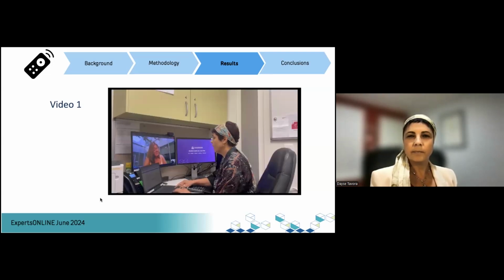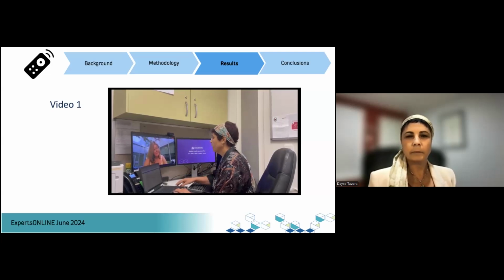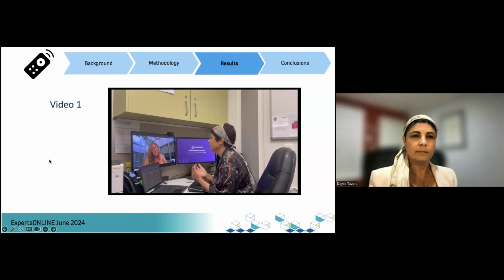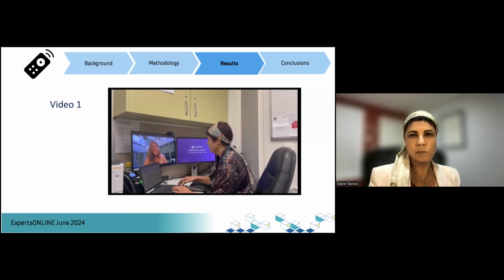Okay. Now I have it with me and I'm just uploading into my system. Okay? Yes. Okay, Sally, I have it now. What I'm going to do is I'm going to create a new setting just for you to try, just for us to make sure that everything is working. I'm not going to make any change on your sound processor. I just want to make sure that if I send you something, you are going to be able to download it into your processor, okay?